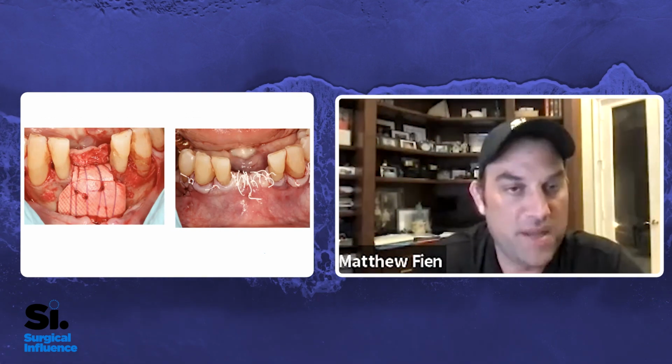And when I get that vertical little defect, I tend to go back to maybe using screws, tacks, maybe even a more reinforced membrane. You actually showed me that, hey, this is a good combination. Go with the stabilizing sutures and a resorbable membrane, but you still need better space maintenance. So combine it with that tenting screw.